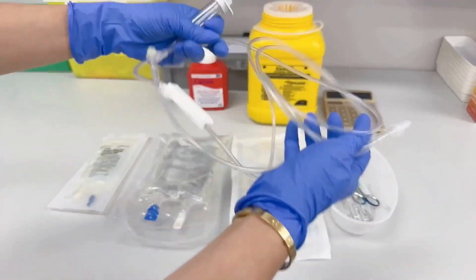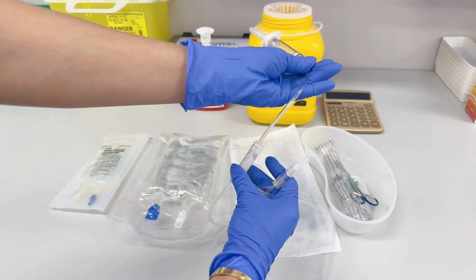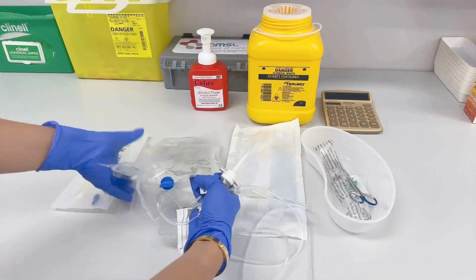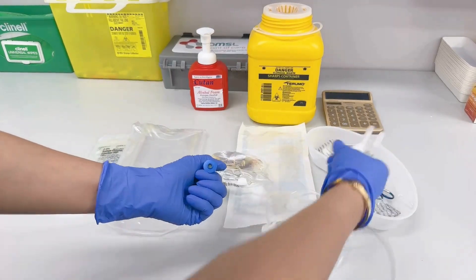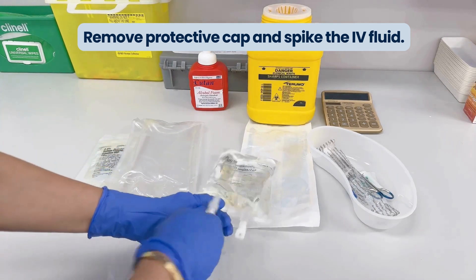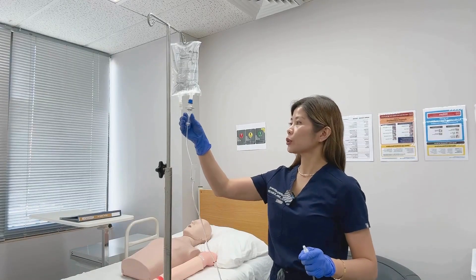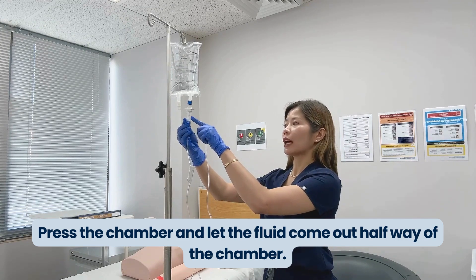The first thing you need to do when grabbing your IV giving set is to close your roller clamp. Then get your IV fluid ready, open it, remove the IV port cover, and poke the spike through your IV fluid. To prime, press the drip chamber and let the fluid fill to halfway.